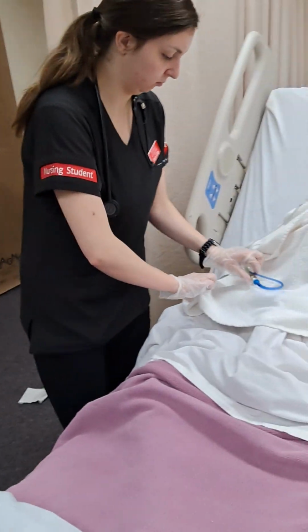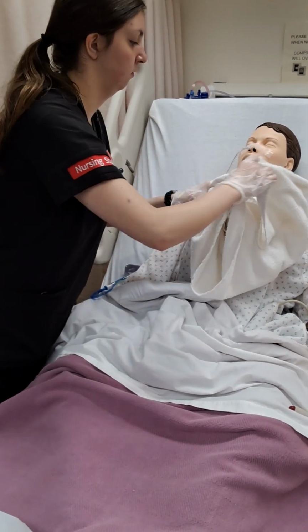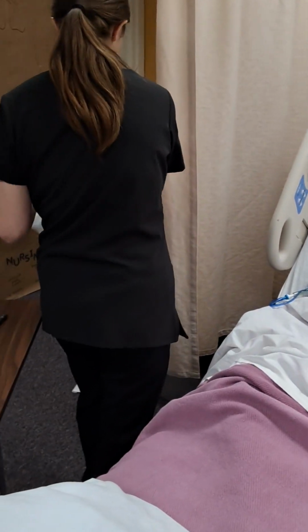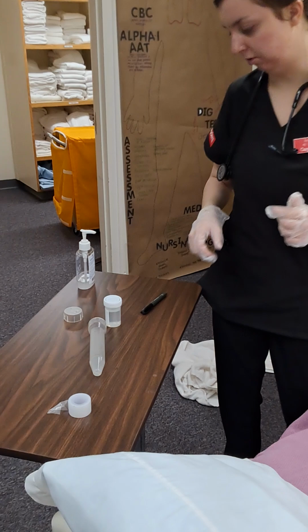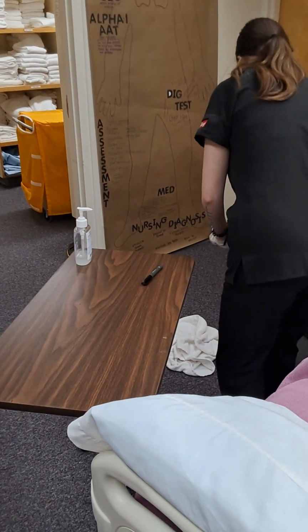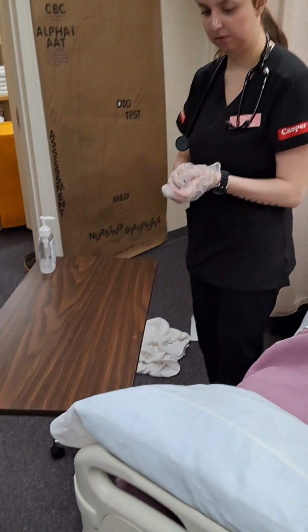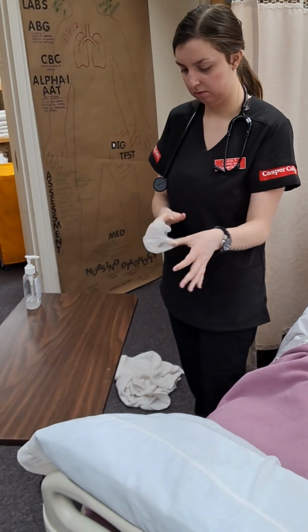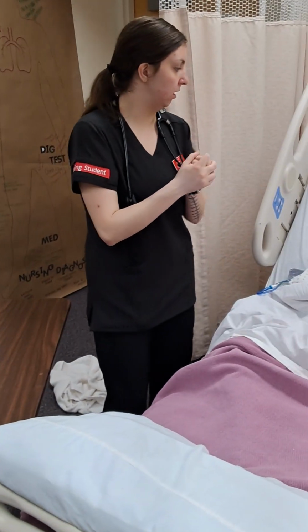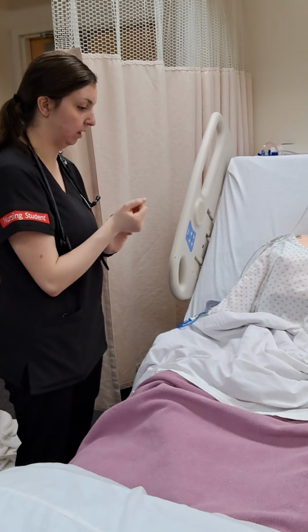I'm going to move this dirty linen. This is going to go in the dirty linen basket. Okay. I'm going to dispose of my equipment. Take off my gloves for hand hygiene. If you pull out your tube or if your tube is causing you some discomfort, press your call light and let me know.